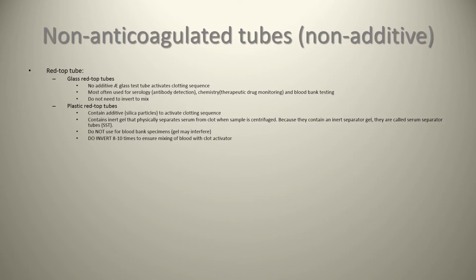I'm sure at some point there will be studies comparing the types of platelet-rich fibrin that you can generate using different types of tubes. For the purposes of this lecture, recorded and created in 2015, we're advocating the use of the red glass tube top. The other tubes that you can get include the gold tube, the mottled red and gray top tube, and the royal blue top tube with a red label.